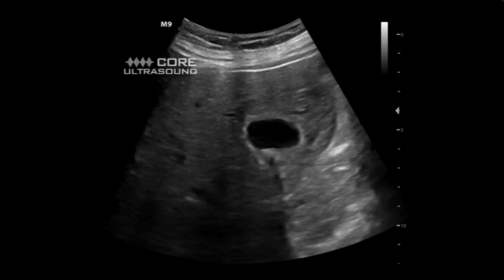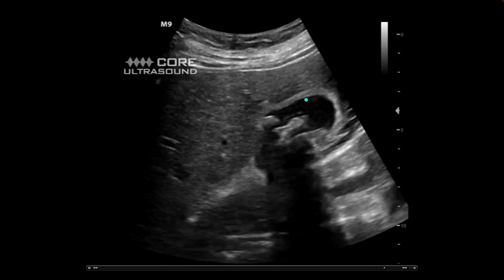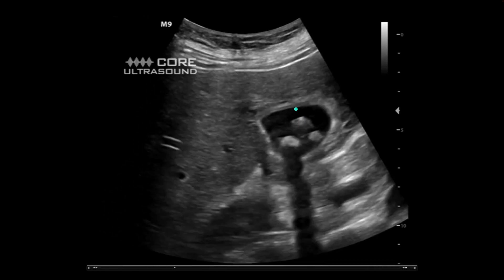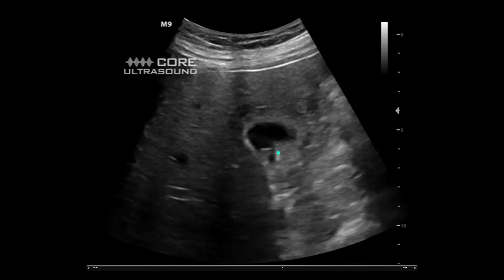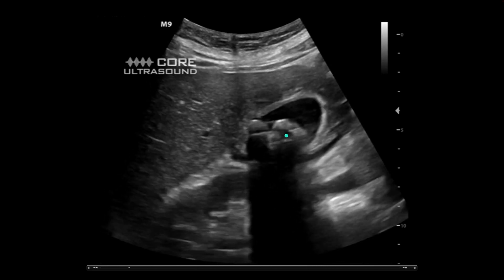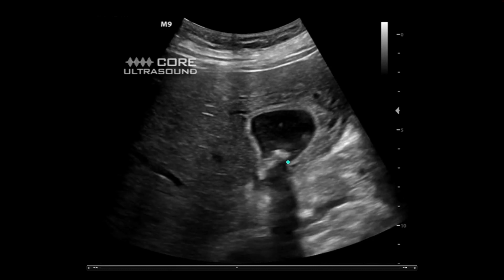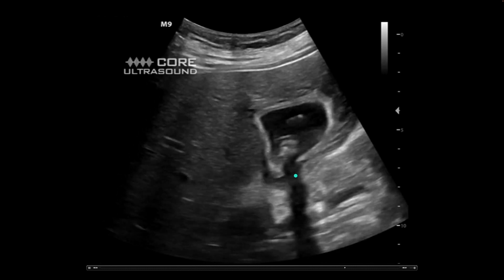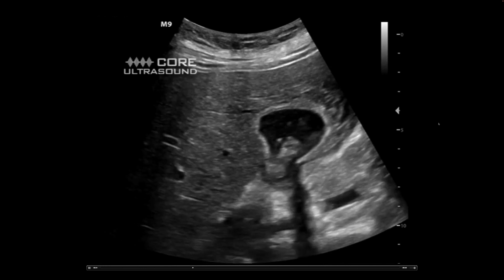The most common example of shadowing is gallstones. You have a gallbladder here with a thickened wall, and we're seeing a bunch of gallstones in it. Notice deep to these hyperechoic stones, we're seeing a black dropout of signal. This is called shadowing.